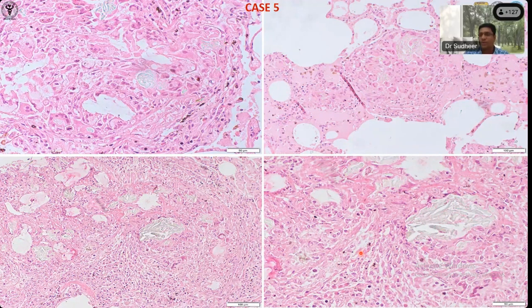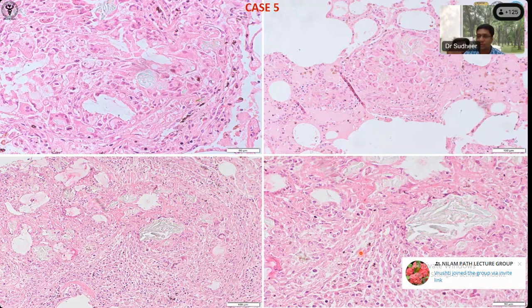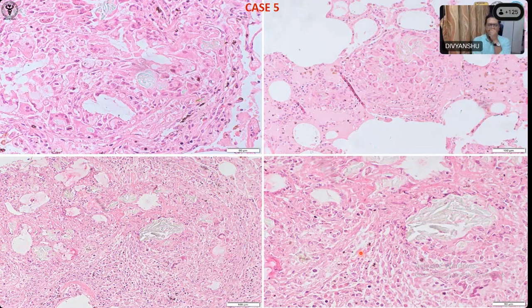Yes, very good. So who told? Gokul, excellent. So whenever you observe these kinds of granulomas predominantly leading to vascular emboli, giant cell reaction, weak granulomatous inflammation associated with pulmonary edema. In this patient, I'll tell you, in each and every slide almost 95% of the blood vessels were occluded by this granulomatous reaction. When we asked the history, he was a heavy drug abuser and recently he mixed many powder drugs. Some of them are oil-based, some water-dissolvable; he mixed in water and injected in the vein. So this is all because of this IV drug abuse.